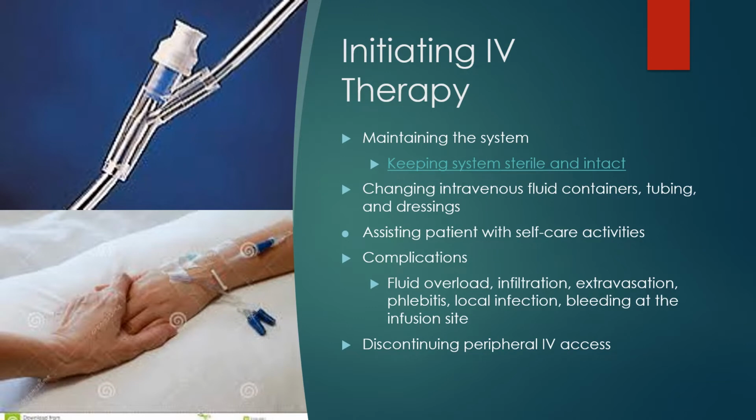The next thing is that we change these on a routine basis. A peripheral IV lasts about 72 to 96 hours. Even if we do everything correct, bacteria starts colonizing, and we talked about this in Concepts 1, about 72 hours in. And because we know this, we know that that's about the same time that we're going to need to change this IV. Your facility would also dictate when fluids, tubing, and dressings all need to be changed, so be aware of those policies for your facility.